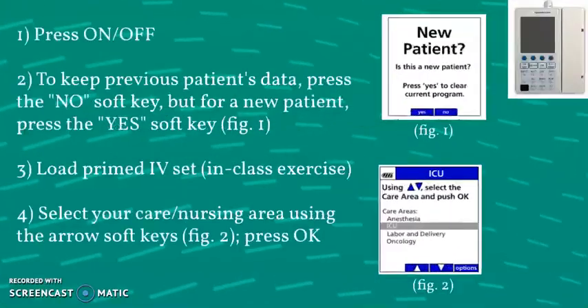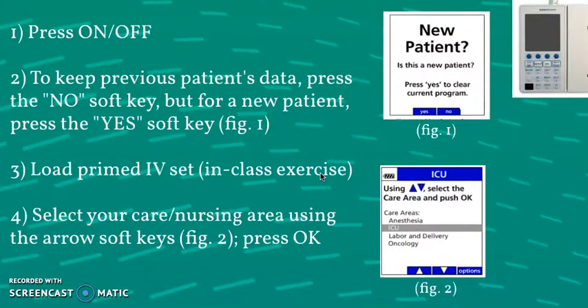Now we'll go straight into programming an infusion. Your initial first step is to take your infusion pump and stabilize it on a surface or IV pole — they can be pretty pricey, so you don't want to damage it. Your first official step will be to power on the pump using the on/off button, and that same button can be used to power it down.